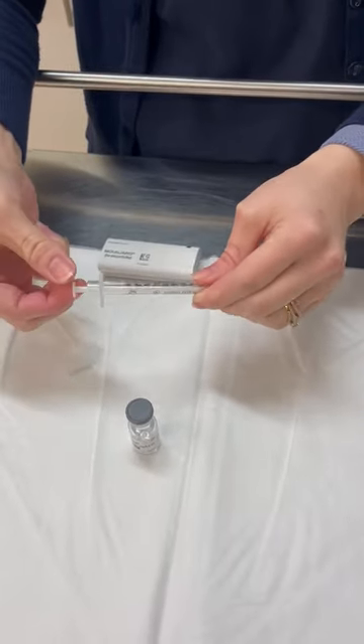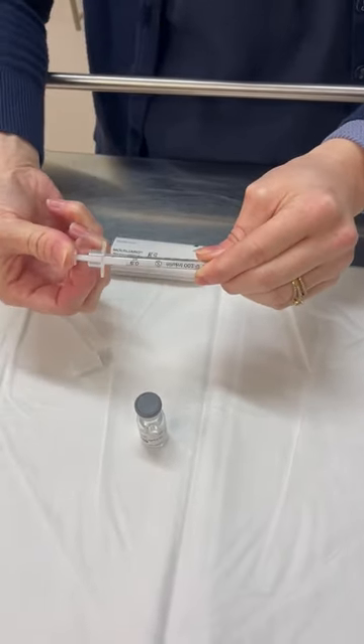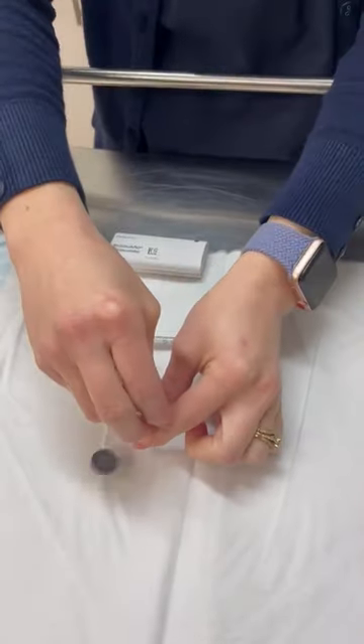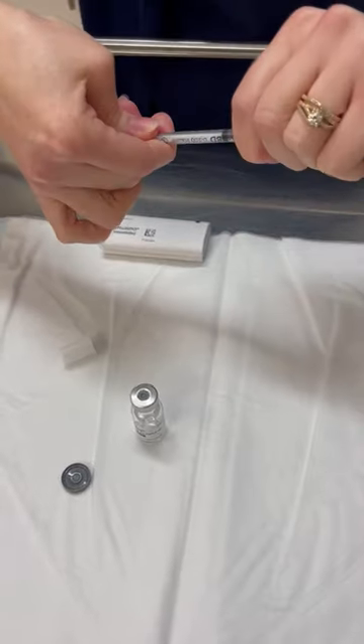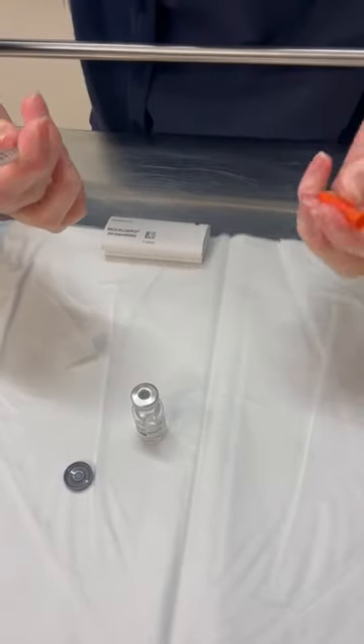Pull this cap off, which then allows you to pull the syringe plunger — you gonna flick the cap off. That which I've already done. Needle comes straight off usually. Yep, so needle's off.